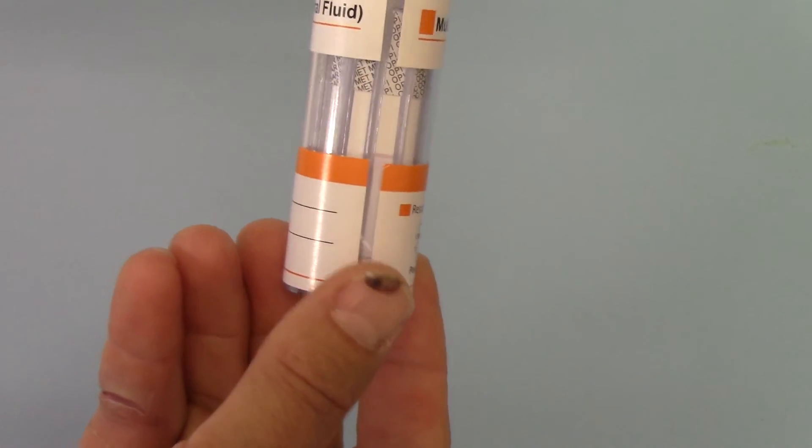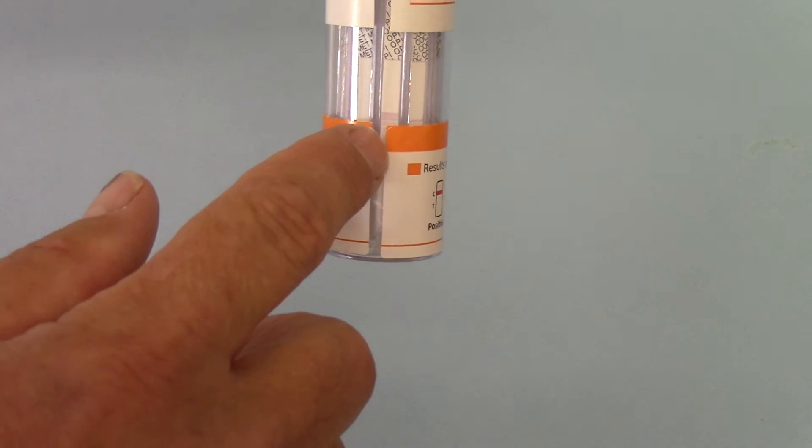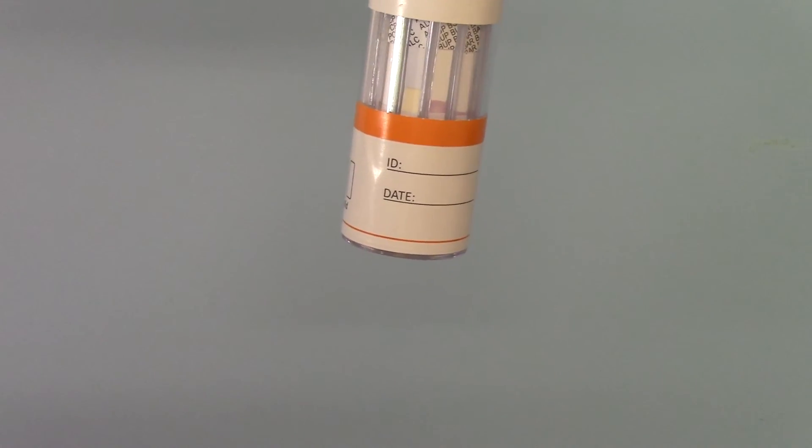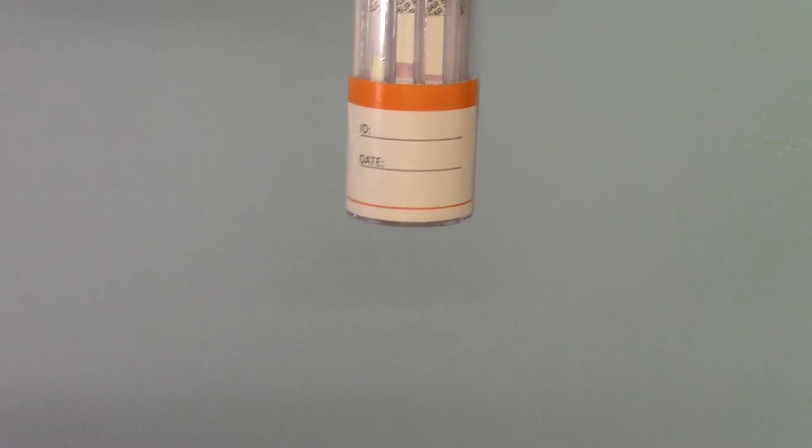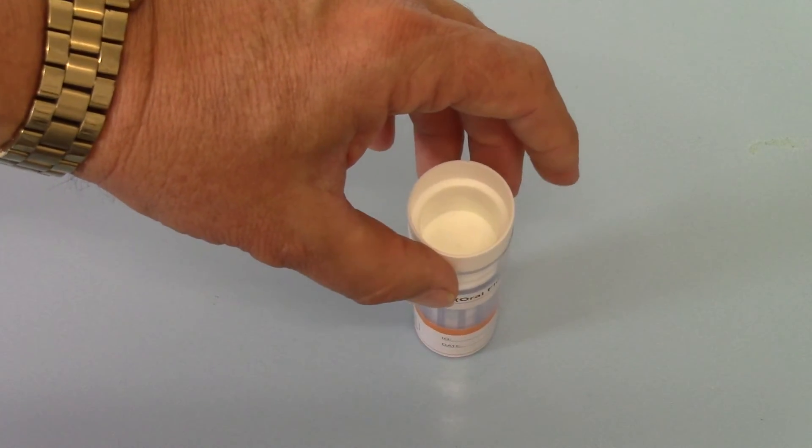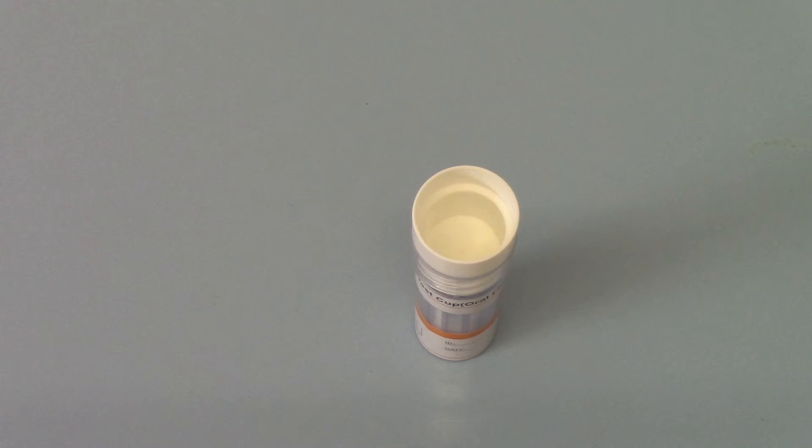And what you will rapidly see if an adequate saliva has been donated is these pink membranes starting to run as the saliva osmotically absorbs up the membranes. And you'll see here this one's starting to run. They will run at different speeds. That's quite normal. Again, best thing to do is to leave that completely flat. Start your timer once it's been put together. And then we're looking to come back and read the results at 10 minutes. So what we'll do now in part four is edit through and show you the results as they show on this particular test.